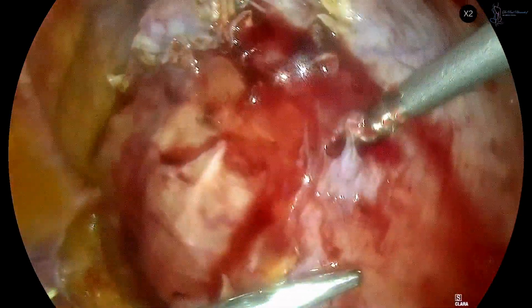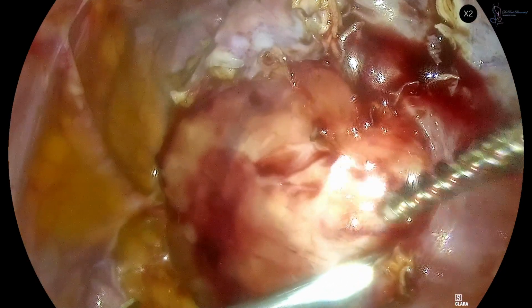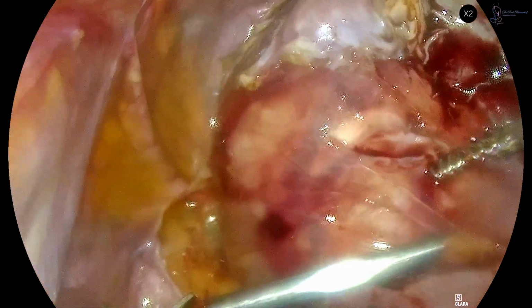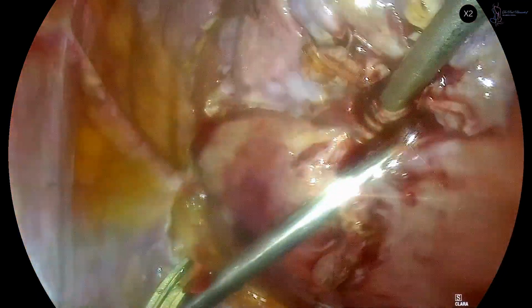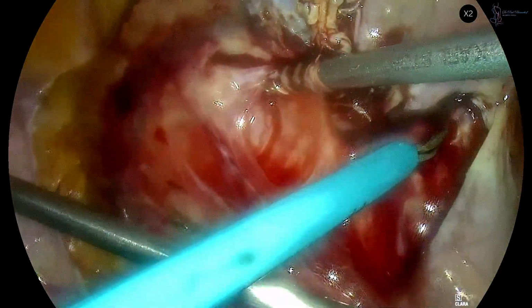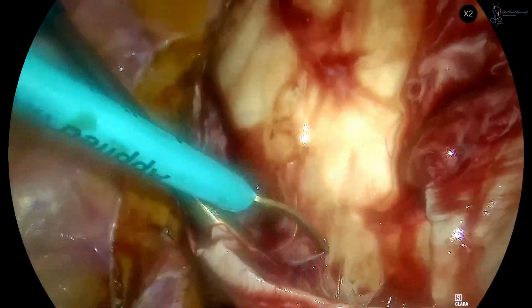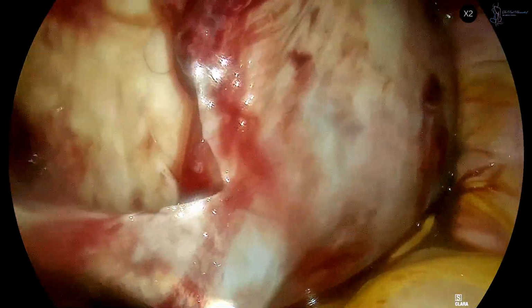Starting dissection of the myoma, using scissors and a combination of traction and countertraction, using the myoma screw and laparoscopic tenaculum grasping forceps. Careful dissection and enucleation of the myoma from the surrounding uterine tissue, using a combination of blunt and sharp dissection to separate the fibroid from the myometrium, while preserving healthy uterine tissue.